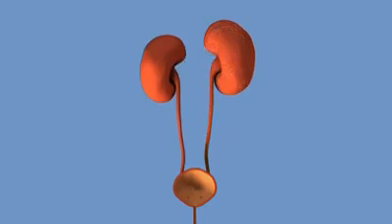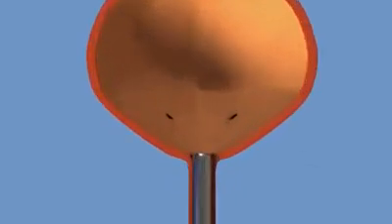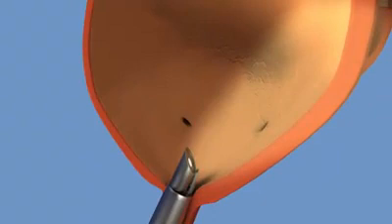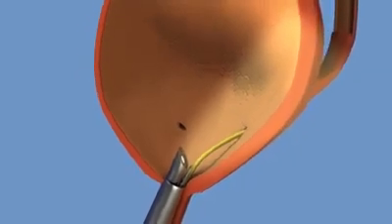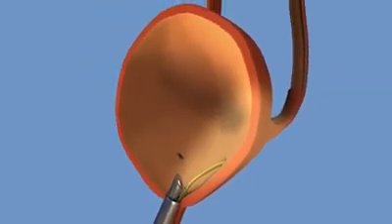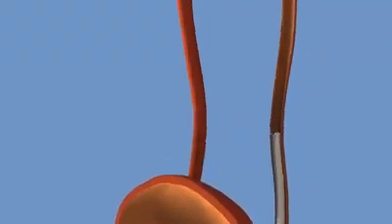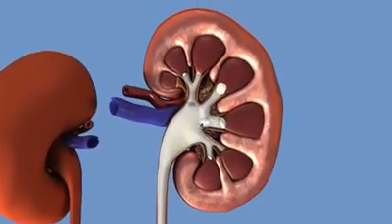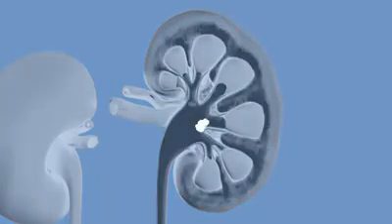Ureteroscopy is typically performed with the patient under general anesthesia. A small tube is passed through the urethra into the bladder, and from there up into the ureter and into the kidney. A contrast study may be performed to assess the anatomy of the renal collecting system before stone removal. A contrast agent, or dye, is administered through the tube into the ureters. X-ray images clearly outline the urinary channel and exact position of the stone.